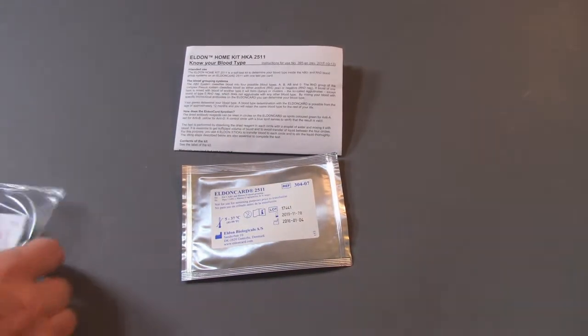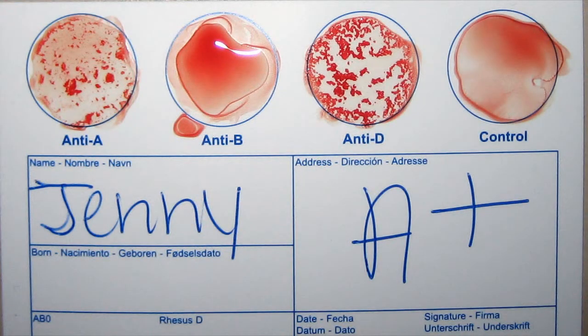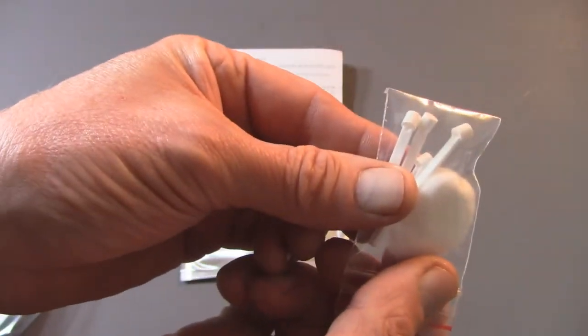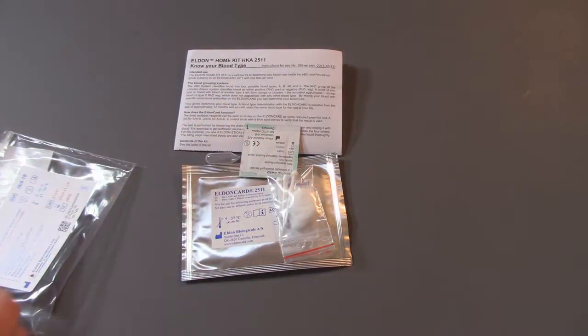The test is performed by dissolving the dried reagent in each circle with a droplet of water and mixing it with blood. It is essential to get sufficient volume of blood and to avoid transfer of liquid between the four circles. For this purpose, use the four Eldon sticks to transfer blood to each circle efficiently and stir the liquid thoroughly.